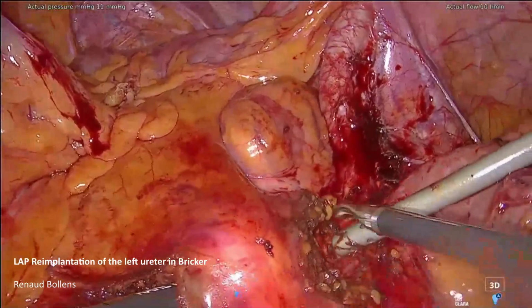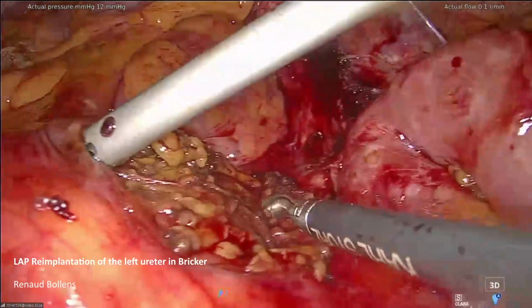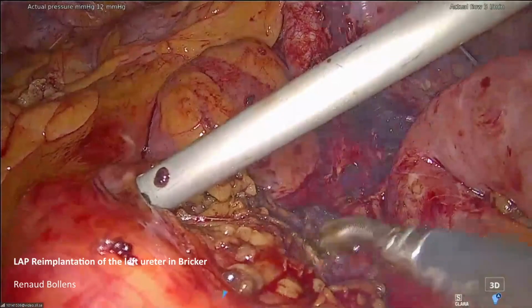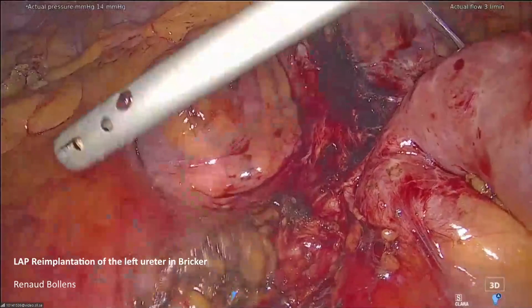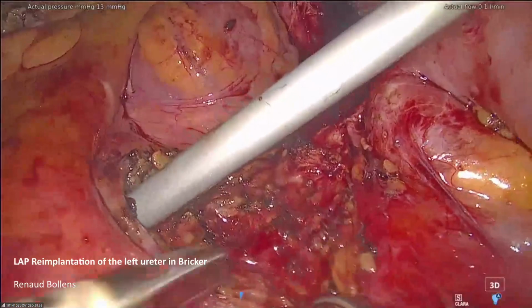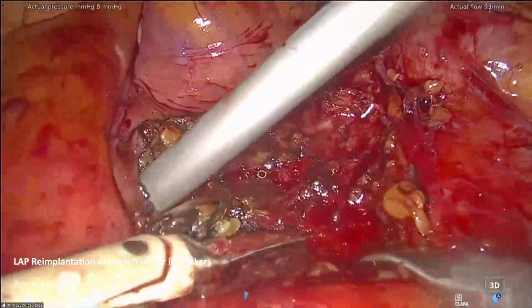It was just a comment. I said that looking at the quality of the ureteral wall, it seems quite soft. Once you freed it from the fibrotic tissue, it's not an intrinsic fibrotic stenosis. That's always a question. It doesn't seem ischemic. Of course, we can always have extrinsic compression, but we will always have a doubt. That's the problem. If we just release the ureter, maybe it's right, maybe it's false. But if it's false, it will be a mess.